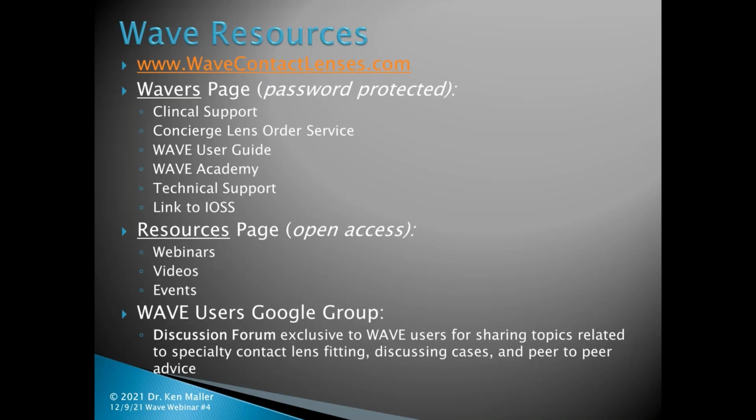My initial lens was around 9, but now she's wearing an 11.5. It took me about a decade to get her up that large, so that I was able to sneak on a little bit larger diameter each year because it was helping me position the multifocal better on that particular eye. Now getting to ortho K cases, 0.2 or 0.3 smaller than the horizontal visible iris diameter.